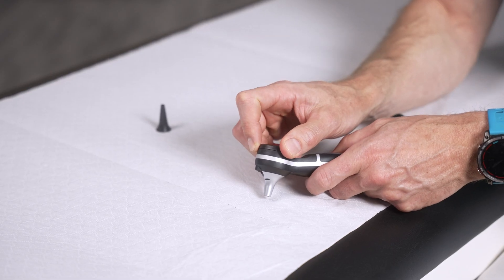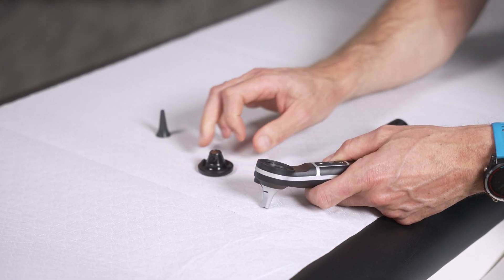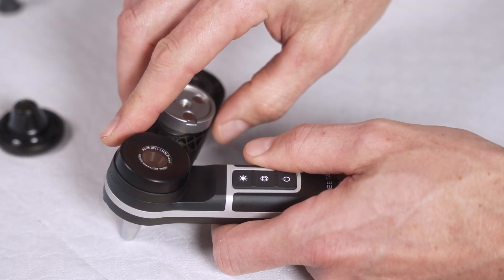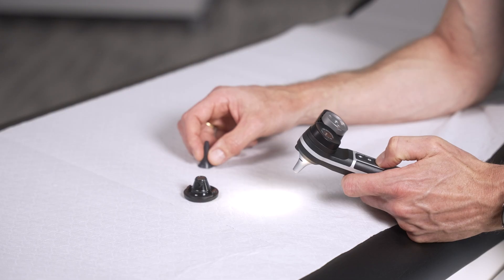remove the X-Change System Magnifier Module with a twisting motion and put it aside. Take the smartphone adapter and insert it with a twisting motion until it clicks into place.